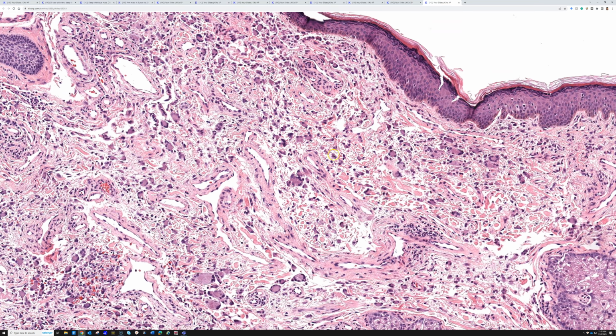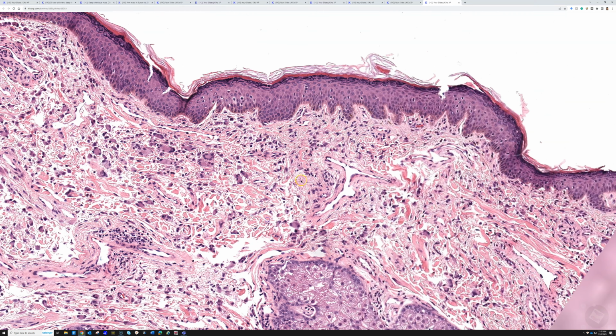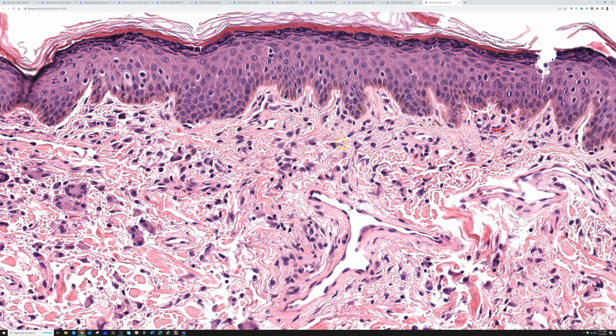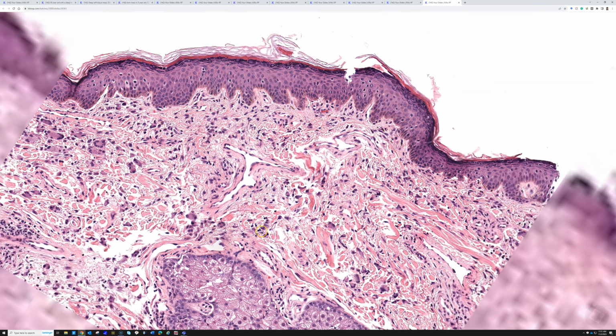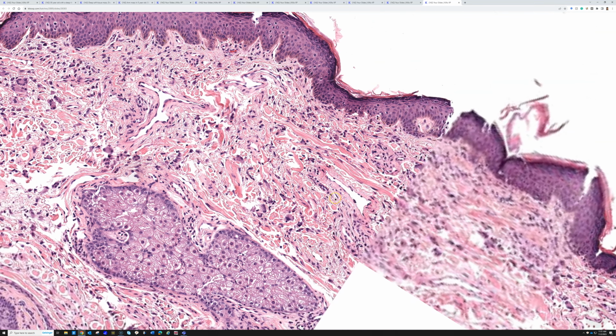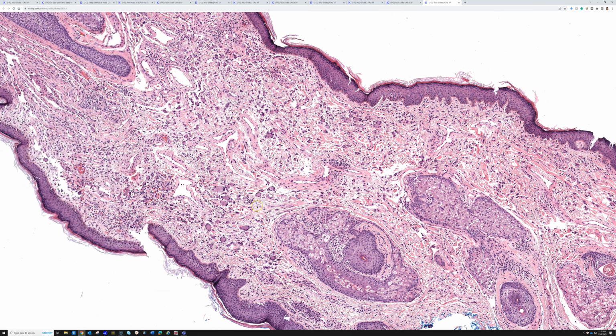And what we see are these big, weird, multinucleated giant cells scattered throughout the dermis, and also some triangular or stellate, spindle to stellate cells, and dense collagen, and dilated blood vessels that are telangiectasia-like. So this is actually just an angiofibroma, also known as a benign fibrous papule. And when you see a weird spindle cell lesion on the nose of an adult, the first, second, and third thing you should think of is probably it's a variation of fibrous papule or angiofibroma.